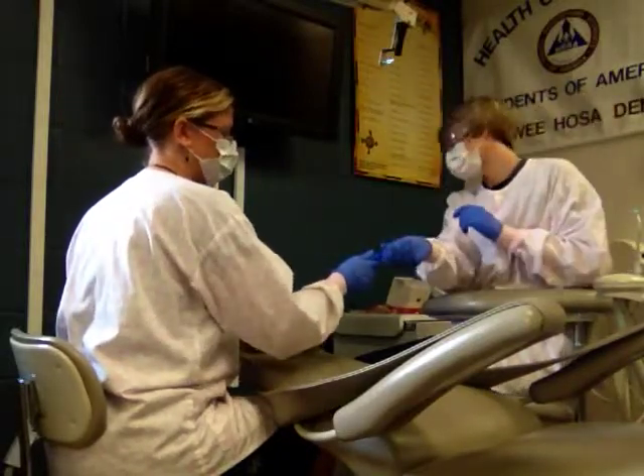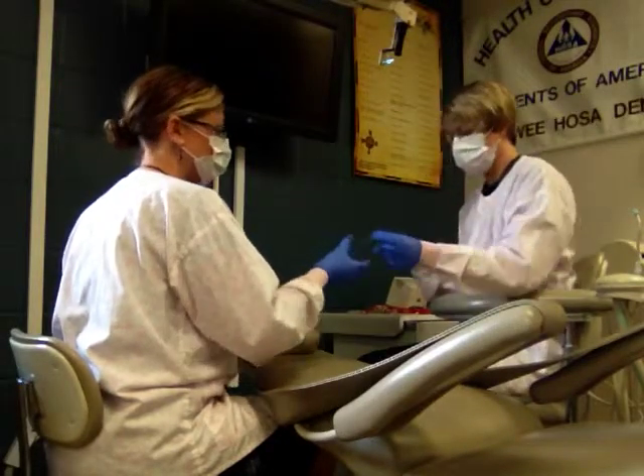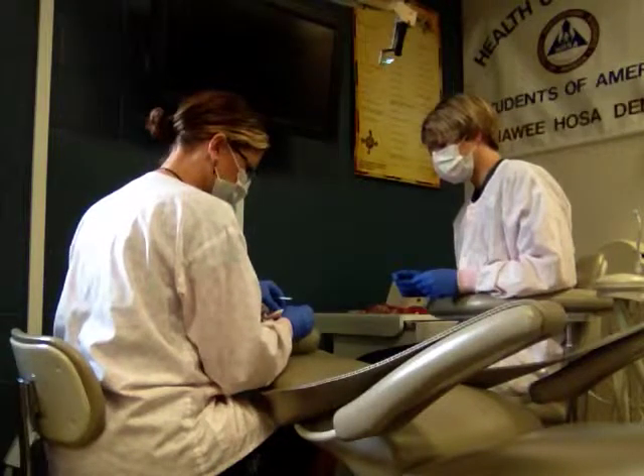Now is when we're going to use the mylar strip. We do it right now so that we do not bond the teeth together. The mylar strip is that clear plastic — it's essentially like flossing it into place.